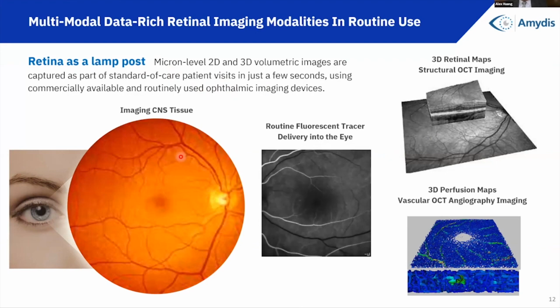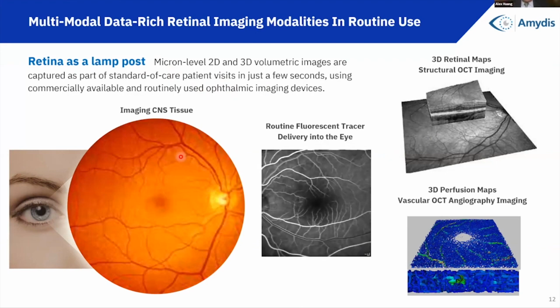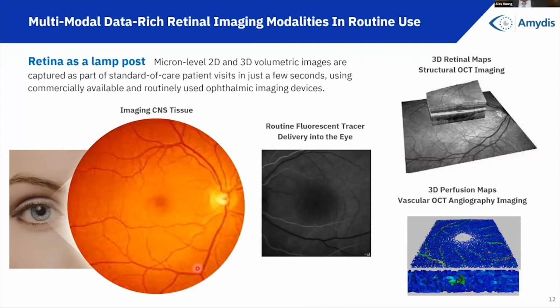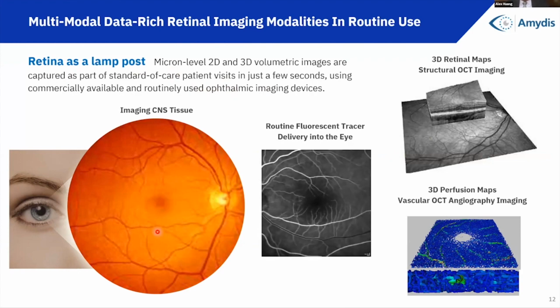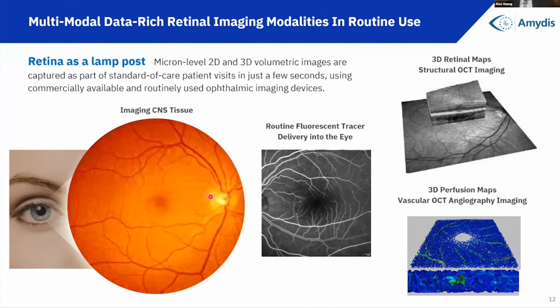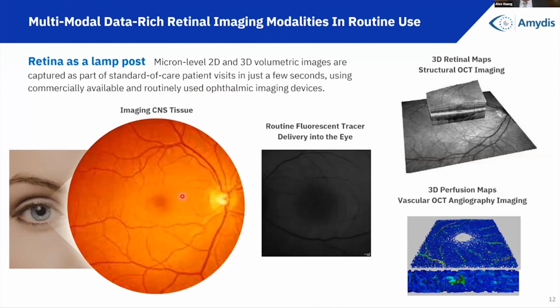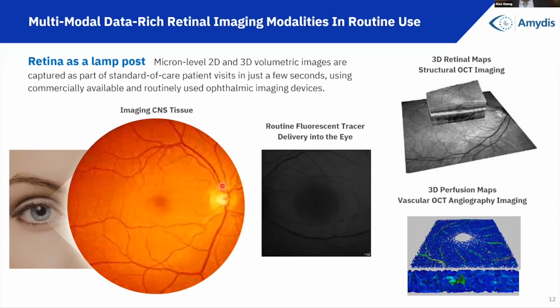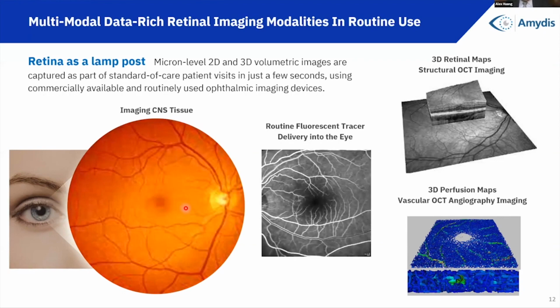Here on the left, we can just take a regular picture. This is a picture like I showed you early in the talk, inside the eye. The red lines are the blood vessels. The orange color tissue is the retina, which is neurons and glia. Effectively, the orange color is your opportunity to look at the brain. This little donut right here is the nerve. It carries the information from the retina to the brain. So imagine you have a camcorder connected to the TV. This little donut is the wire connecting the camcorder to the TV. So we can already look at the brain in high resolution simply by taking a picture inside someone's eye.